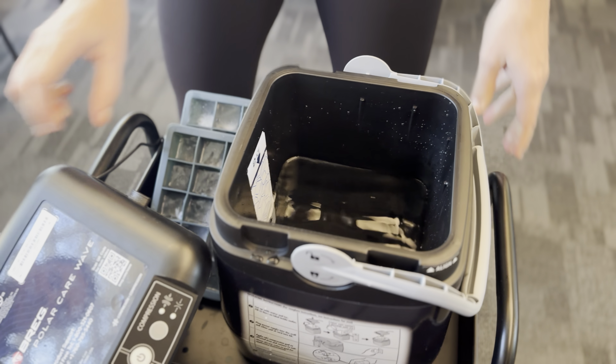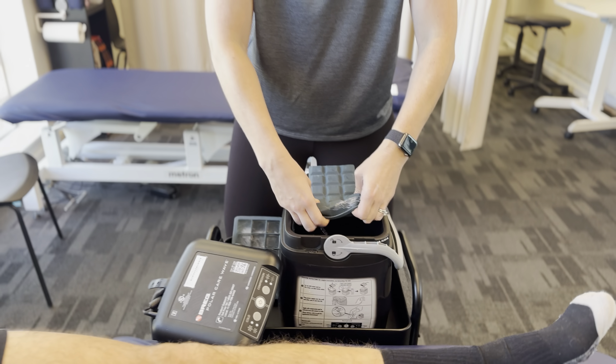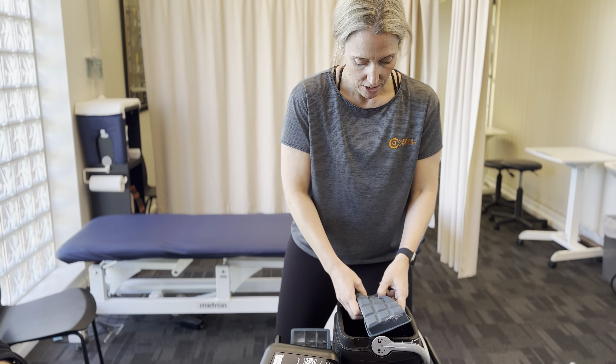If you're using this at home and using it daily, I would say going to the service station and grabbing just a five kilogram bag of ice — that will probably be the quickest and easiest way. So all you literally have to do is put in probably the amount of ice to fill it up.